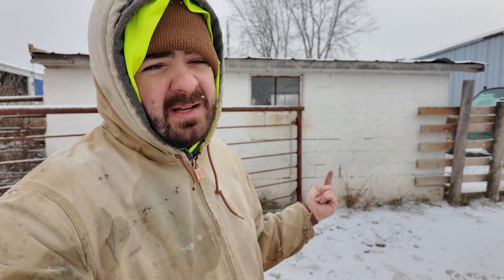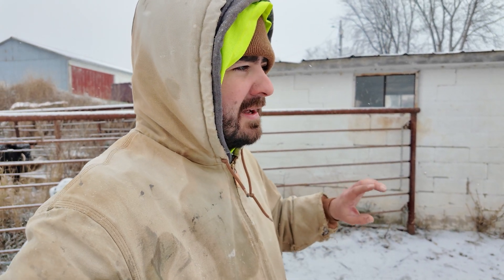We're going to lift her tail up, and I'll explain how you try to do this as accurately as possible. I don't consider myself an expert by any means — this is not vet advice. I'm not a vet, I'm not licensed. Please don't take anything I say as strictly true; I'm just going to repeat what I've learned doing this for the last two years.